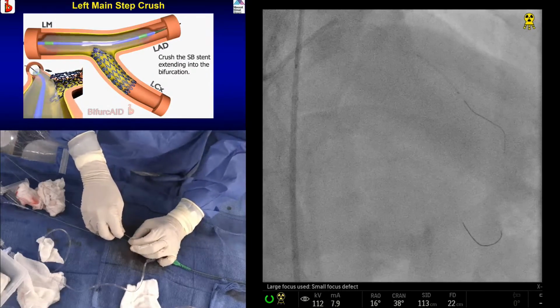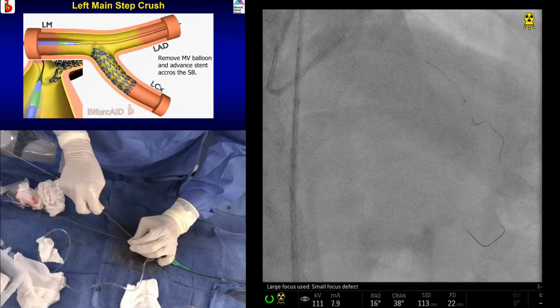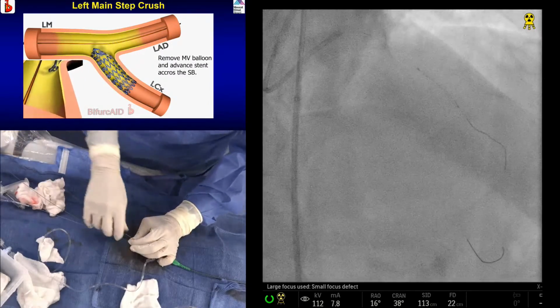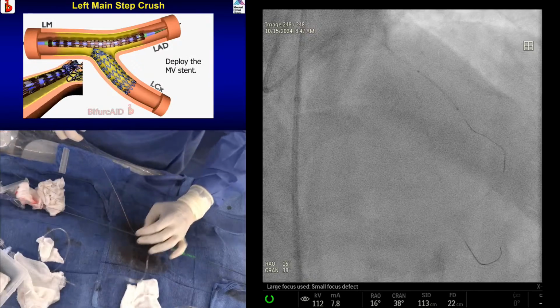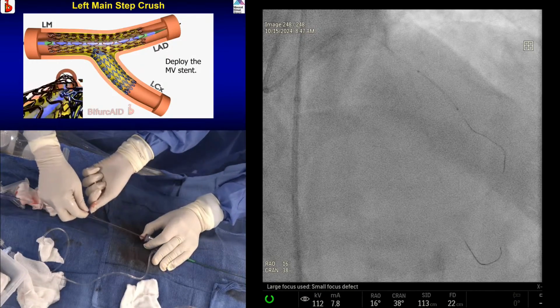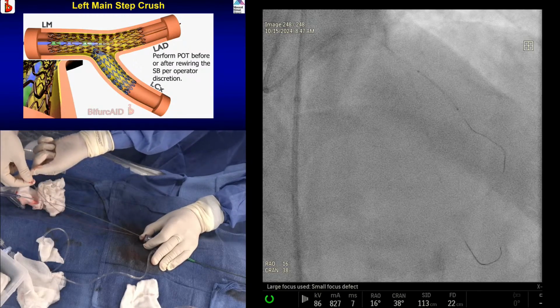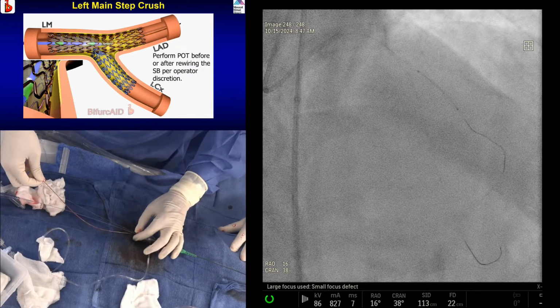It's not going. See, now what happens is when you're trying this, the stents can be a challenge with the 6 French. Get us the 2.5, because the launch did not go. We have the 2.5 balloon, just do a crush, step crush. The step crush, yeah.